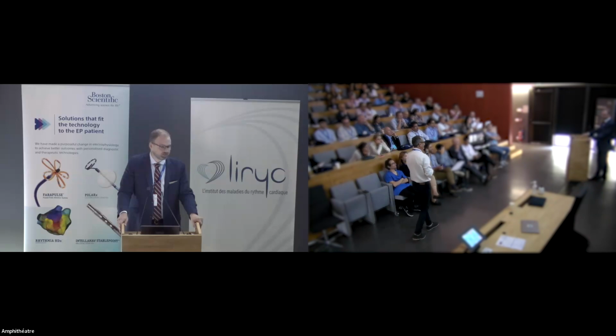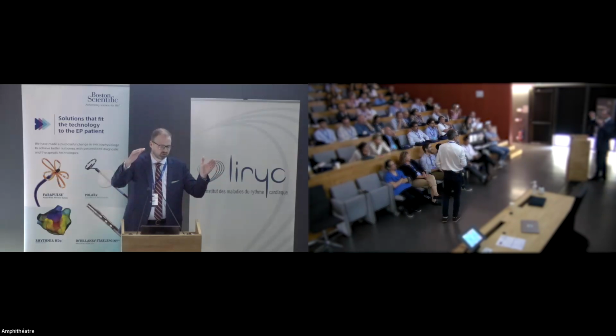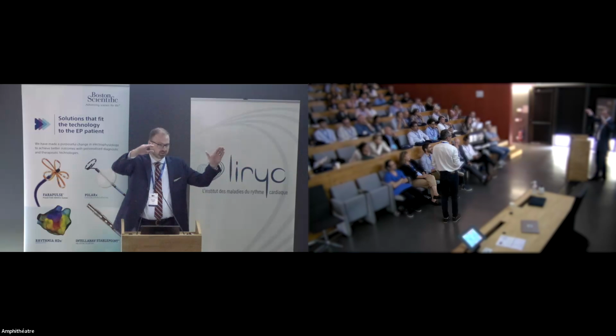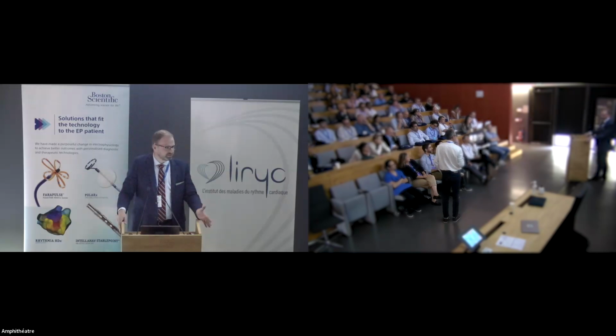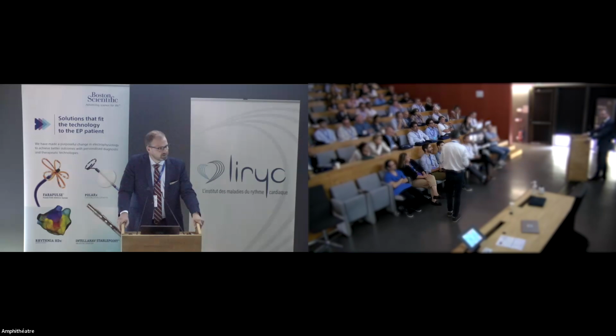Your maximum lesion depth is really controlled by your amplitude and your catheter design. That's going to get you to wherever that magical 400 volts per centimeter is. And then the rest of your waveform design is just to fill that in to its maximum level. So I think the results will potentially be similar, but we'll have to see.